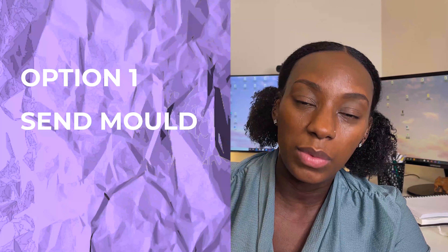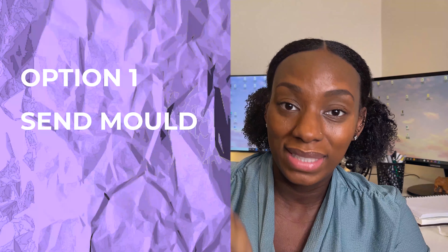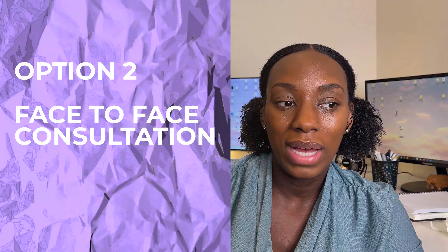What was the first step? Firstly, apply online. Once you applied, they gave you two options. One, they'll send you a mould and you'd have to bite into it and send it back. Two, you had to go for a face-to-face consultation, which is what I did. I went for a face-to-face consultation, the lady scanned my teeth and talked me through the procedure. Yeah, it just seemed good.